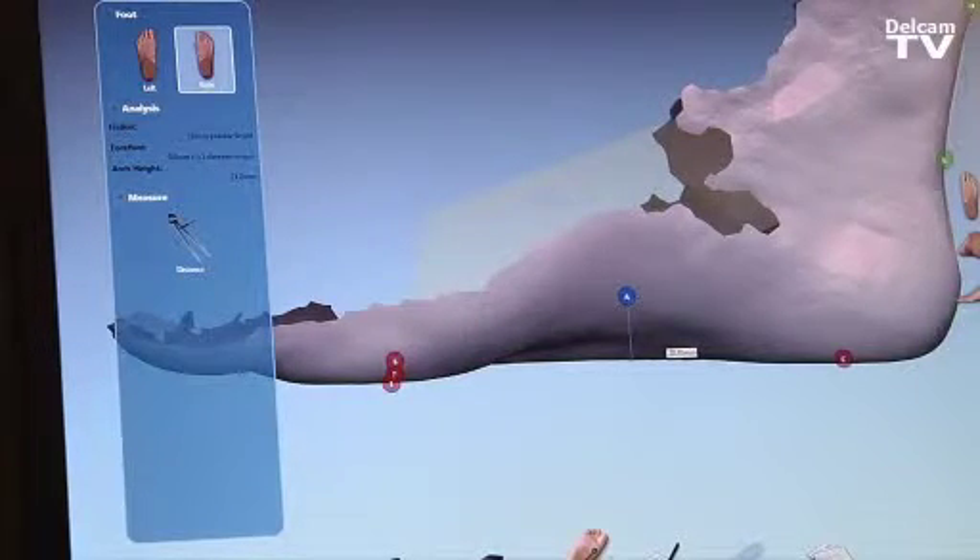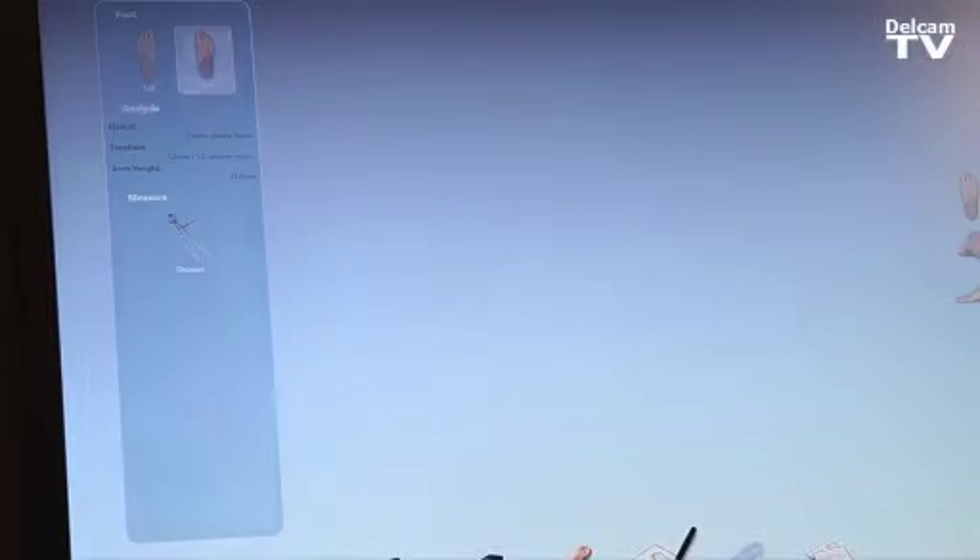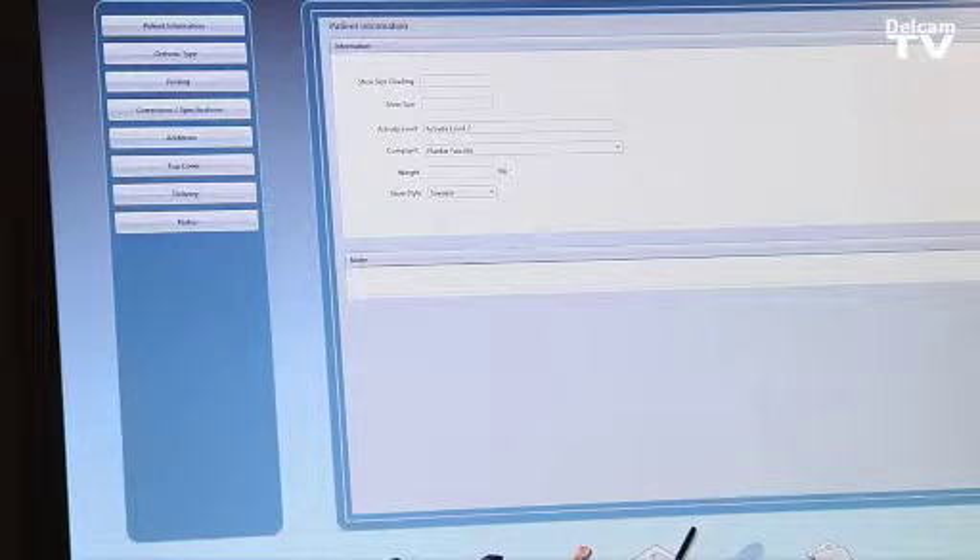To finalize, we can select the apex of the arch, or the highest point of the orthotic, which the doctor can identify and the software measures in real time. Once we are happy with the alignments, we can proceed to the next step, which will be to order the type of orthotic, the shoe sizing, and so on.